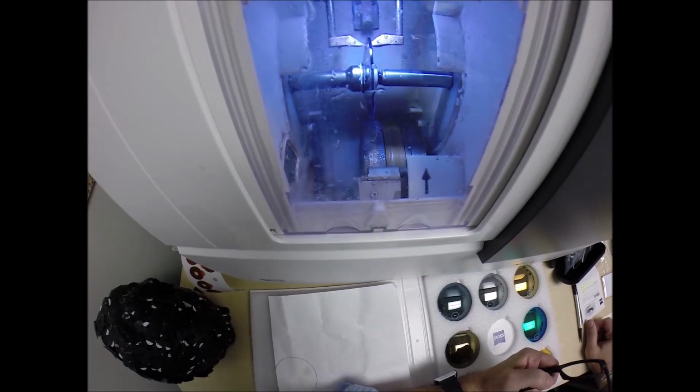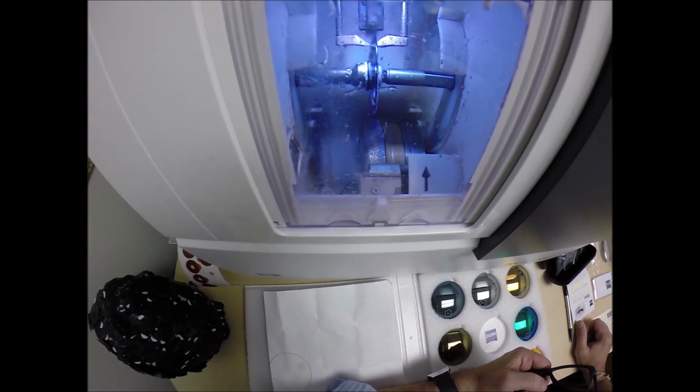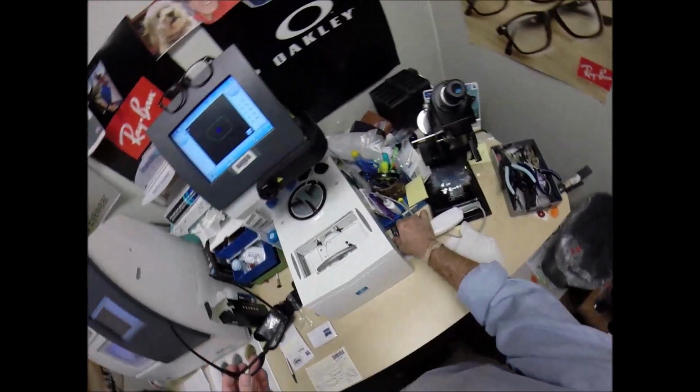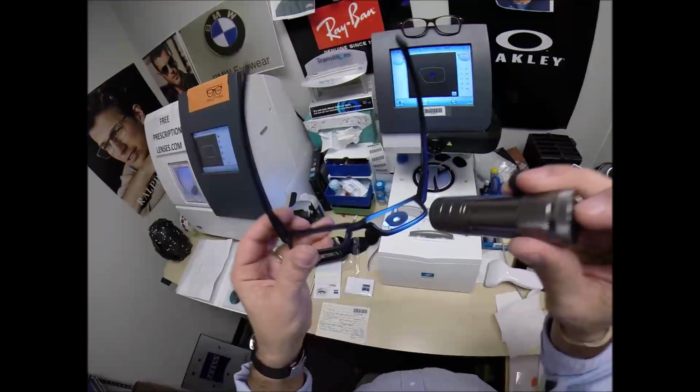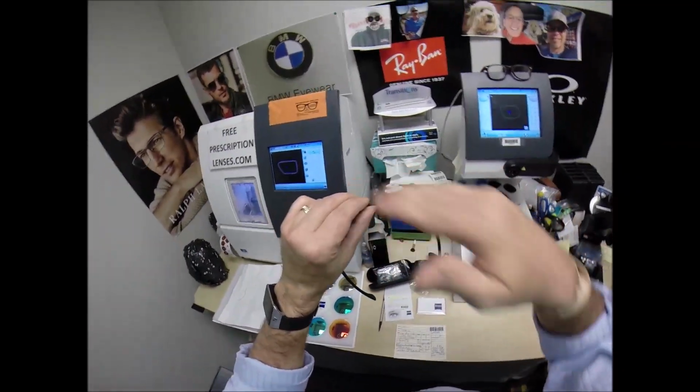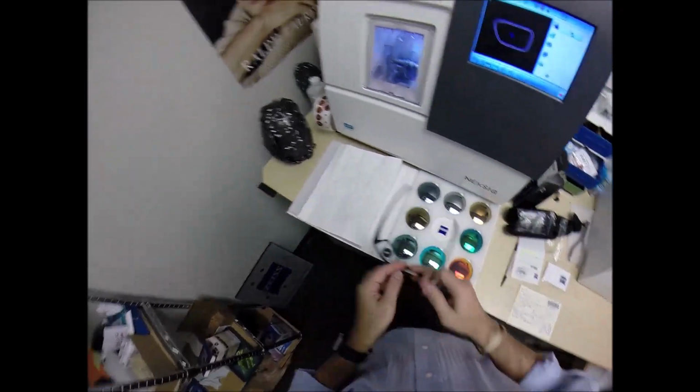And then measuring the thickness of the lens at every point to know exactly precisely where to place the bevel so you have the least amount of edge thickness showing. A Jim of which you got nothing. You got no edge thickness whatsoever. That's because I ordered the thinner lenses. I had the lens match the frame curvature.